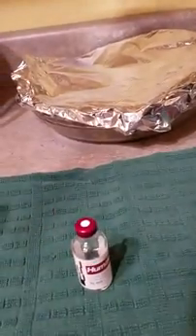Now, we didn't film this, but I have washed my hands. That's the first thing I do when we get ready to put new insulin in Michaela's pump. And then I get a nice clean towel, and I just put everything I need on it so that I don't get distracted by everything else on the counter, like pumpkin pie and things like that.